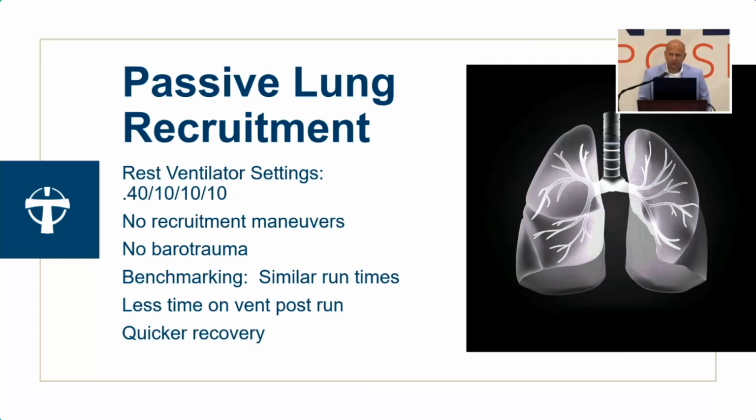And so, we got her off on day 52 of ECMO on resting vent settings, 40%, rate of 10, delta P of 10, and 10 of PEEP. And 3 days later, she was on trach collar. 5 days later, we pulled her trach out. She's sitting up and talking.